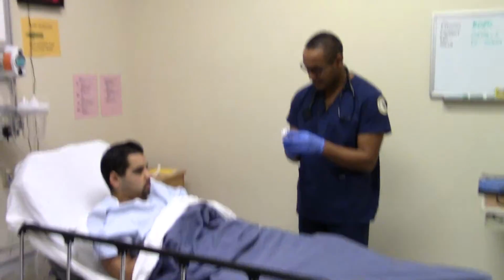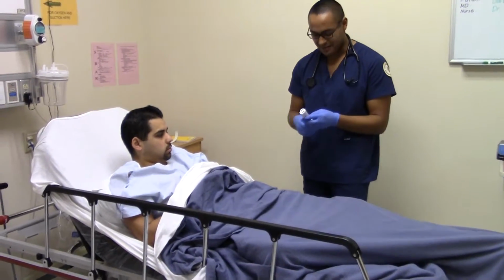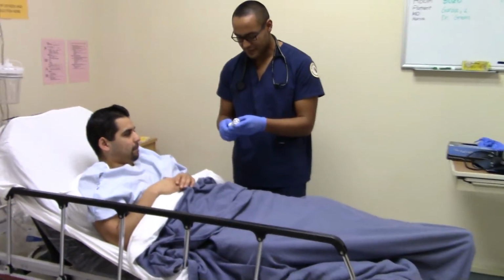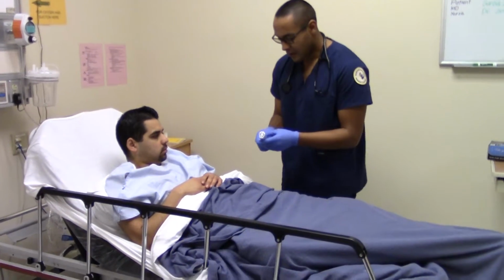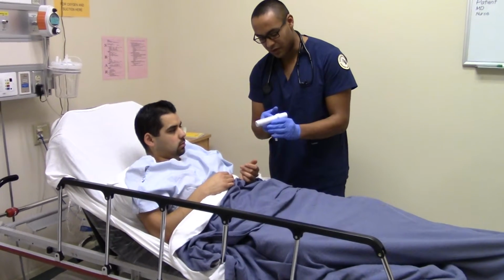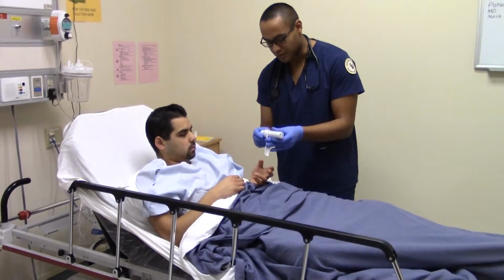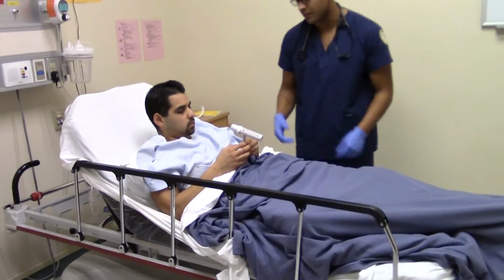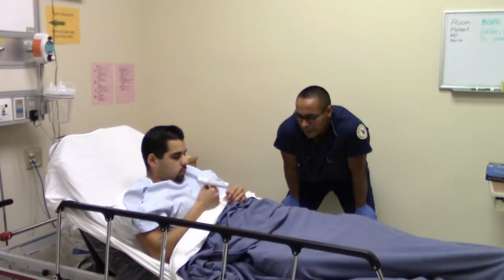How do you feel? You feel like you need coffee yet? All right. You sure? Okay, so make sure. All right, go ahead and same thing, Christian. Breathe out 3 times, and I'm going to see the difference, how well the number increased. Go ahead and breathe out as hard as you can.